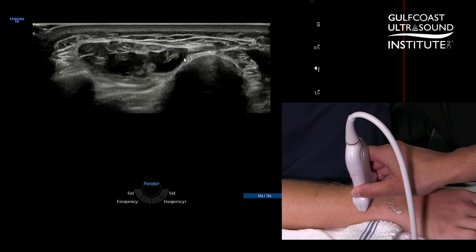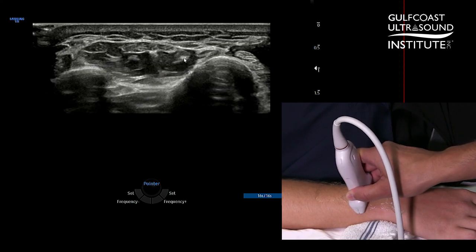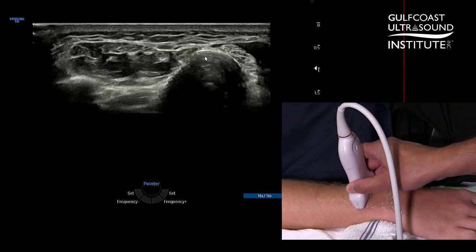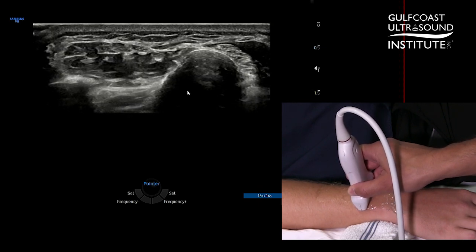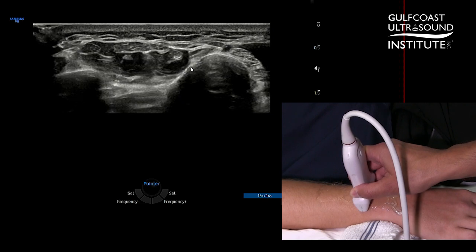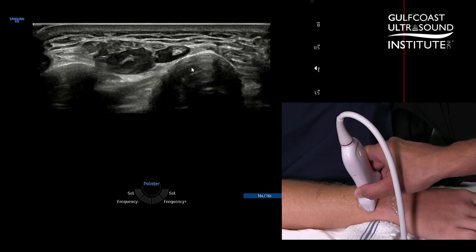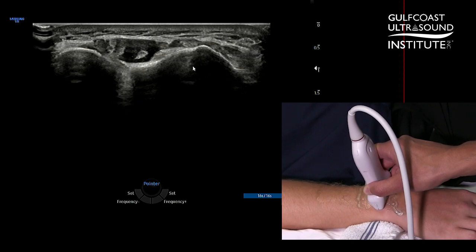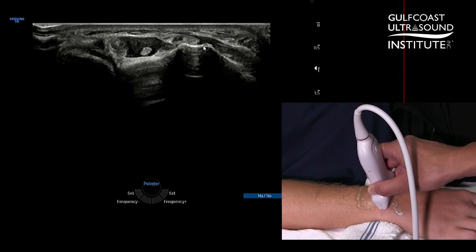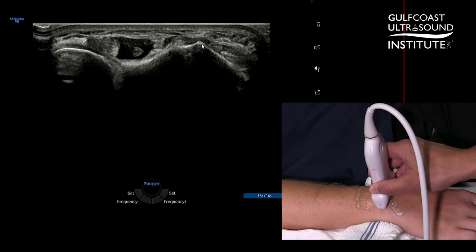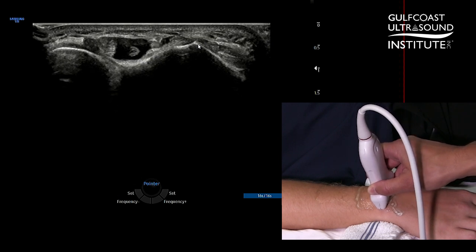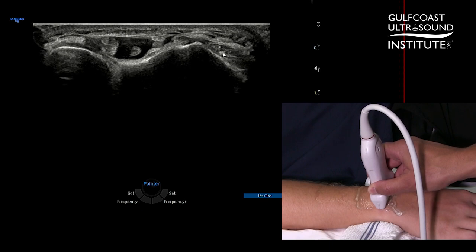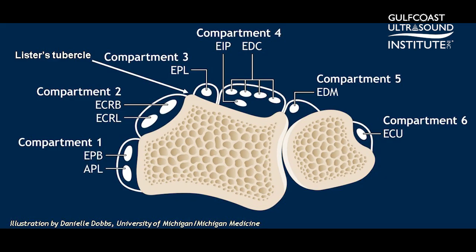As I put my transducer down at the distal forearm, I'm looking for two bones here — one on the radial side being the distal radius and on the ulnar side, the ulna. As I scan more distally, we'll see that the dorsal aspect of the radius will flatten out. I'm looking on the dorsal side for a little ridge known as Lister's tubercle, which separates compartment number two from compartment number three. We know there are six extensor compartments, and compartments two and three are divided by Lister's tubercle, right here on the dorsal aspect of the distal radius.